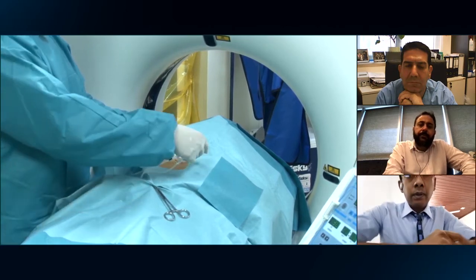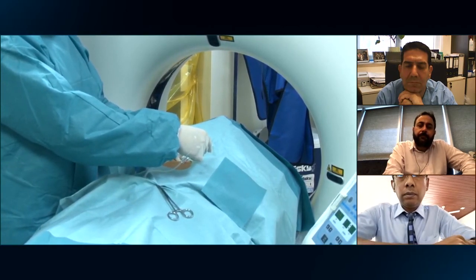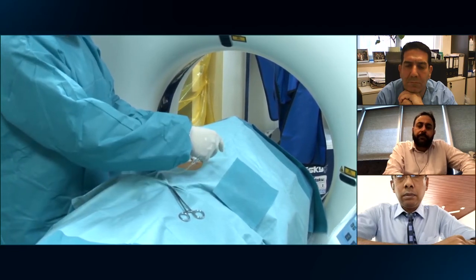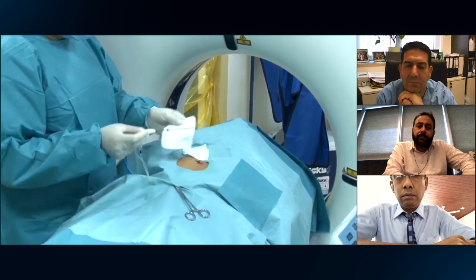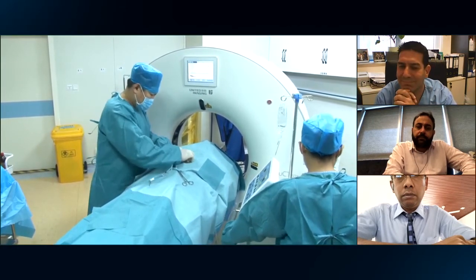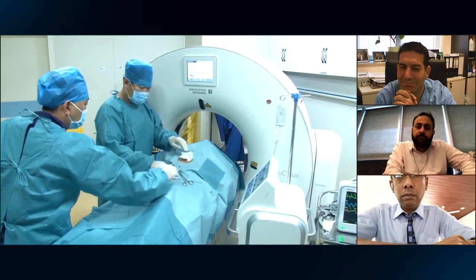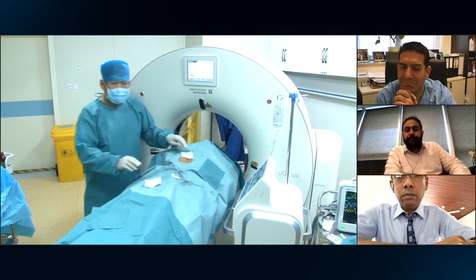Please, just a minute. Okay, 3 minutes. He withdraws the antenna, and the operation is almost finished. Good case, well done.